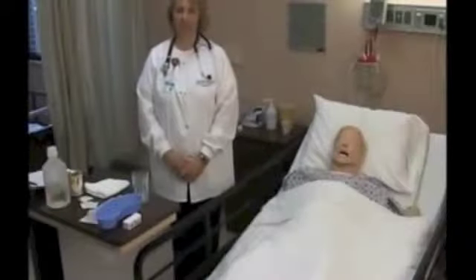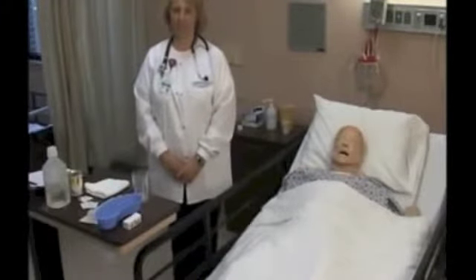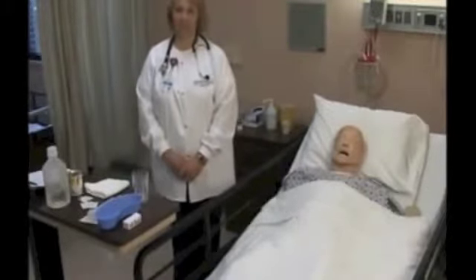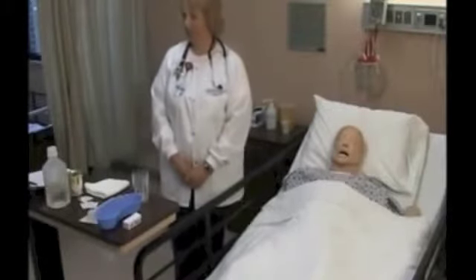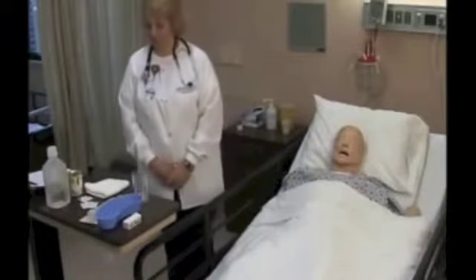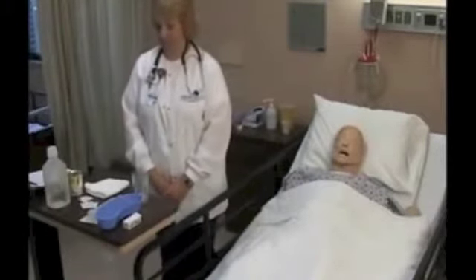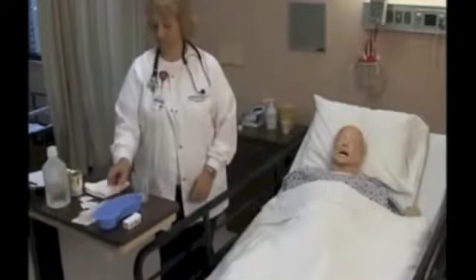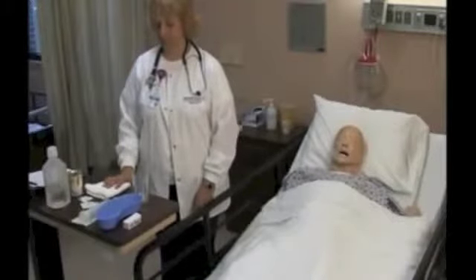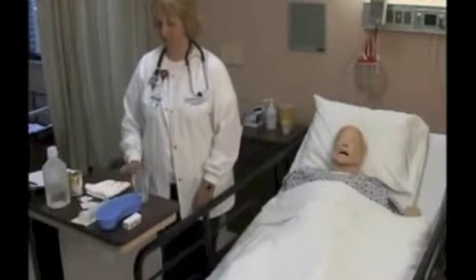The following is a demonstration of the skill validation abdominal assessment and tube feeding via a PEG tube or a G-tube. Gather the appropriate supplies. You will need the appropriate tube feeding per doctor's order, tap water, 60 milliliter catheter tip syringe, 3 240 milliliter graduated cups, a bath towel, emesis basin, stethoscope, and pH paper per hospital policy. Wash your hands before entering the patient's room and provide for privacy.